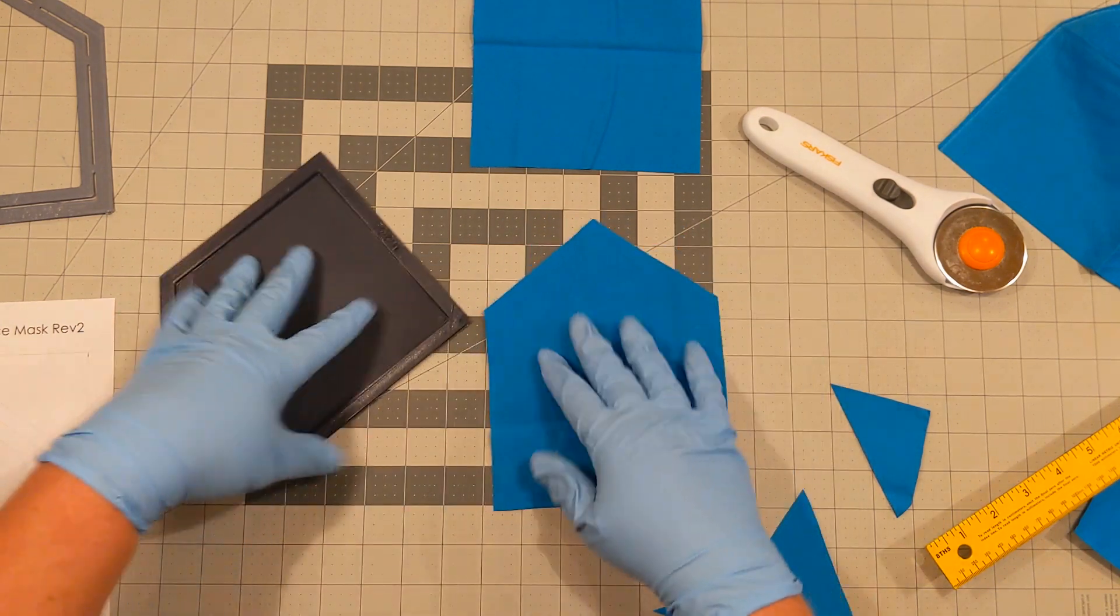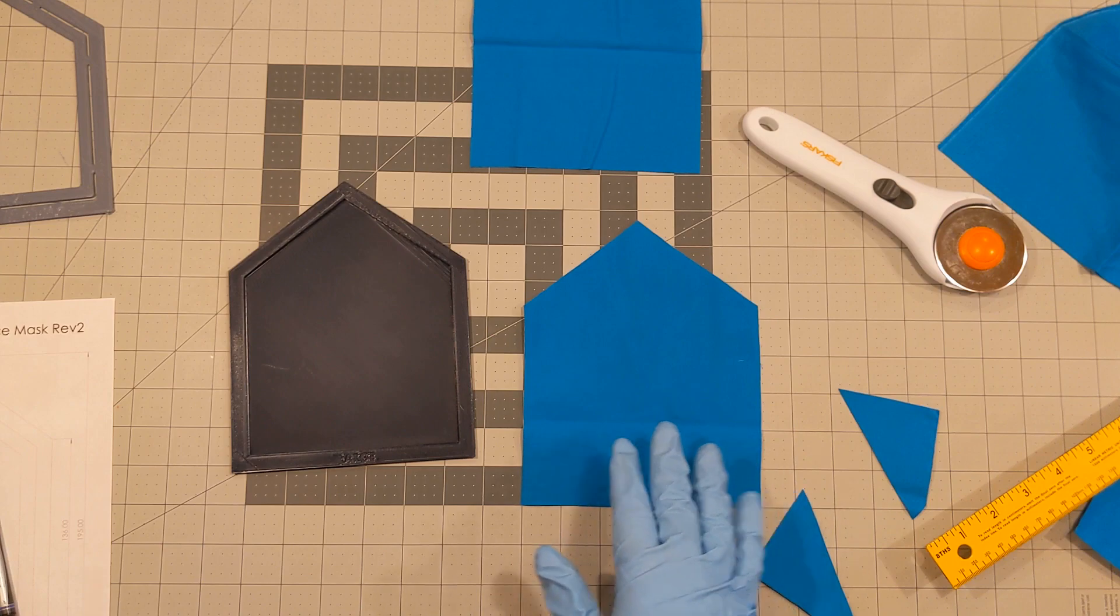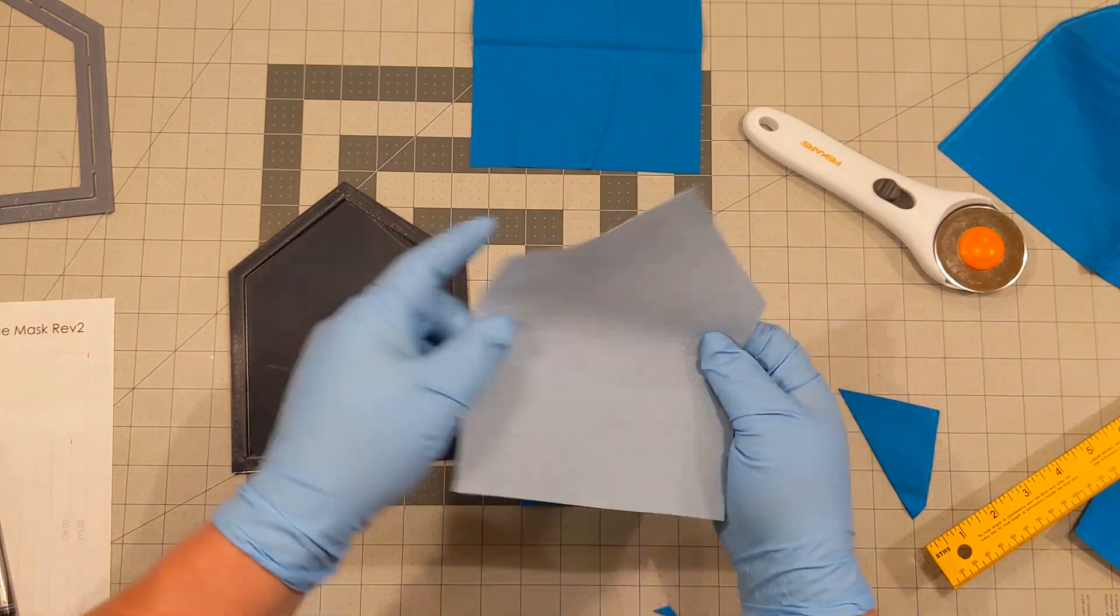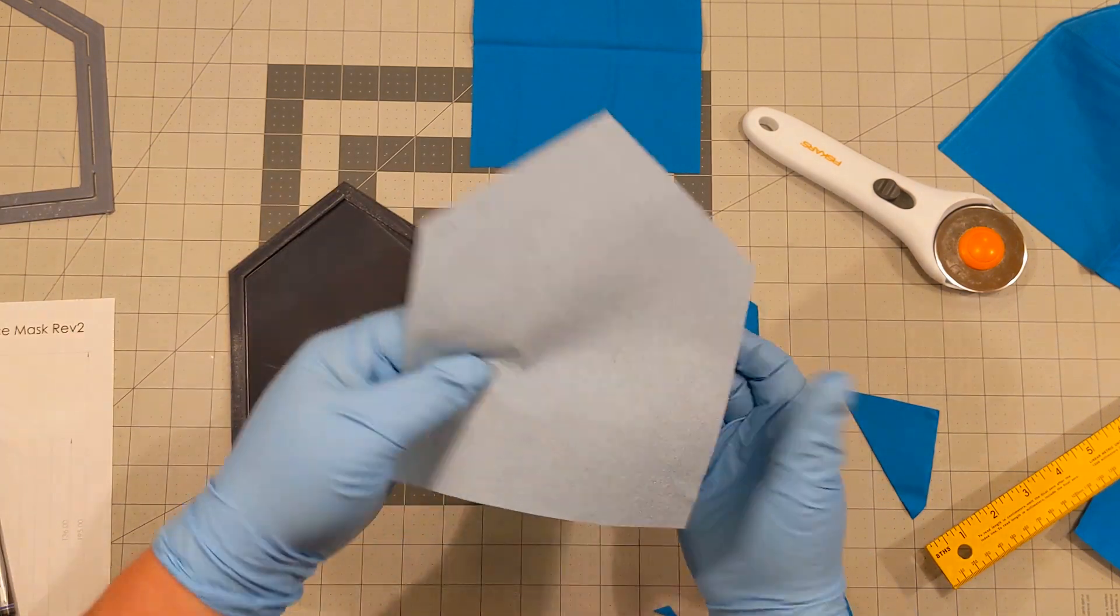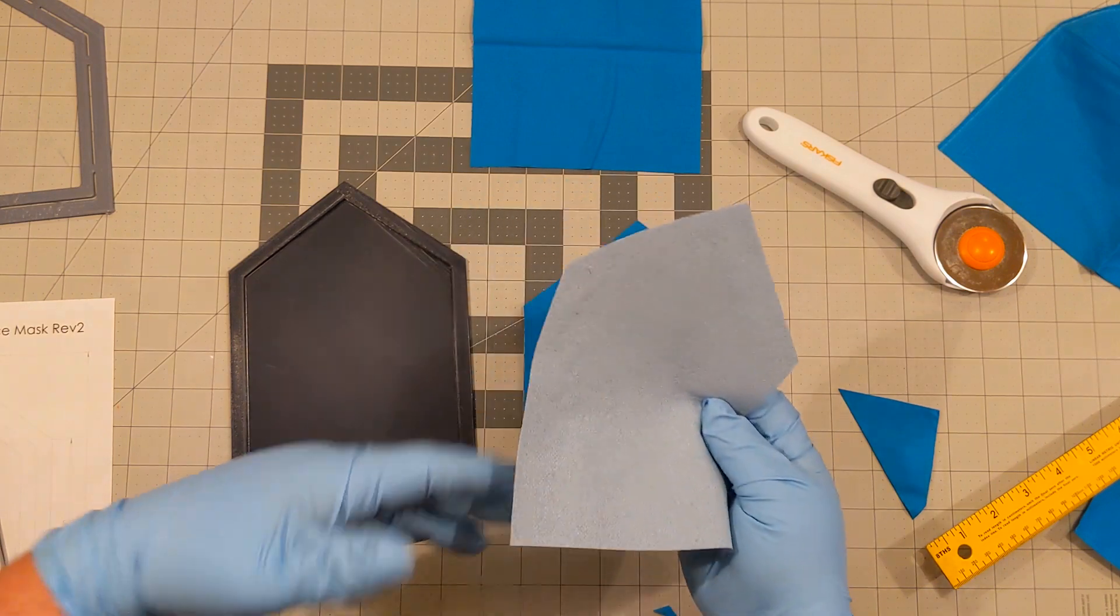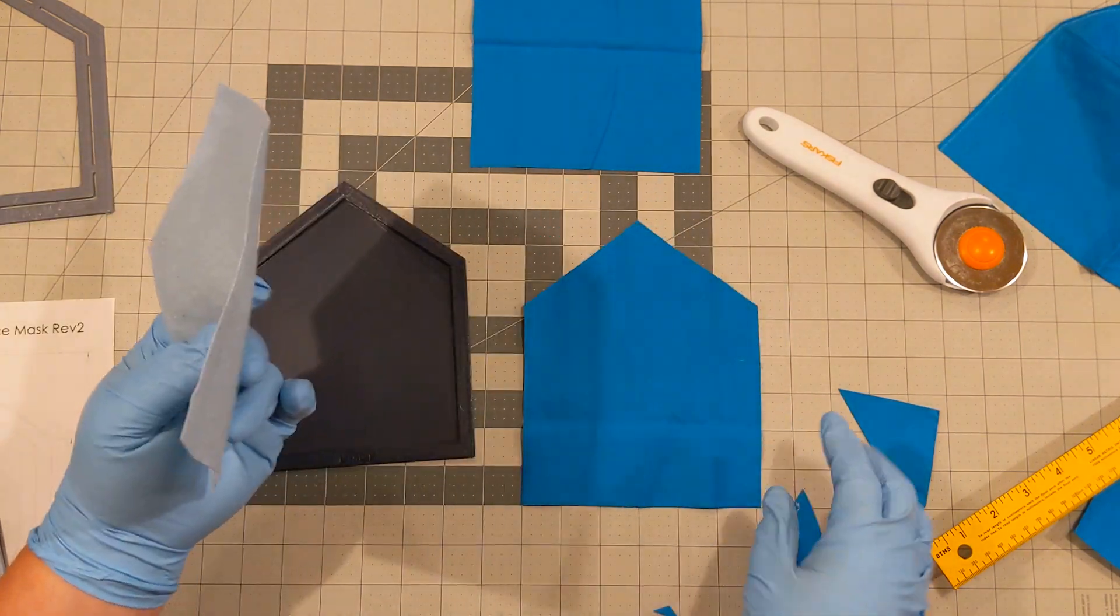Now, this same cutting template can be used to cut out your blue paper towels if you wanted to. That's an option. Or your other materials as well.